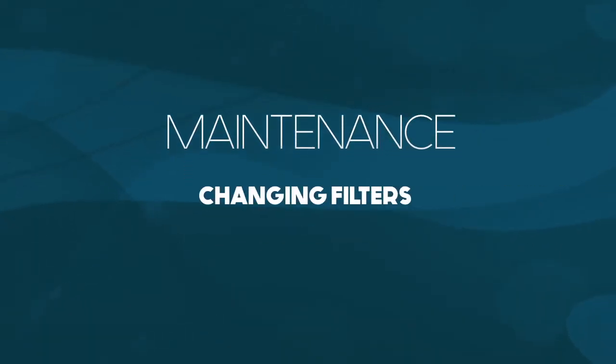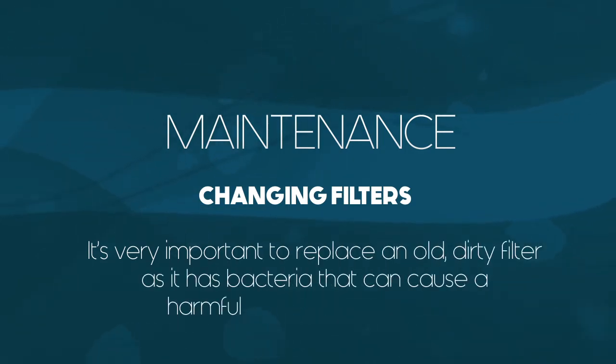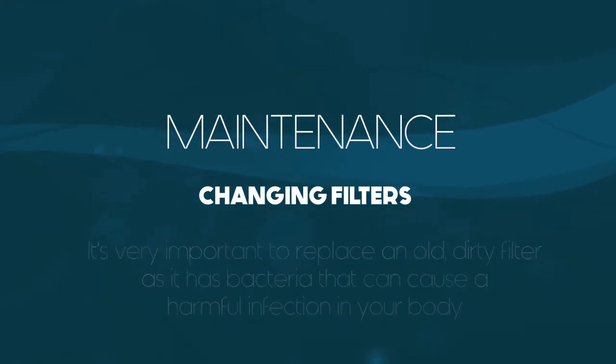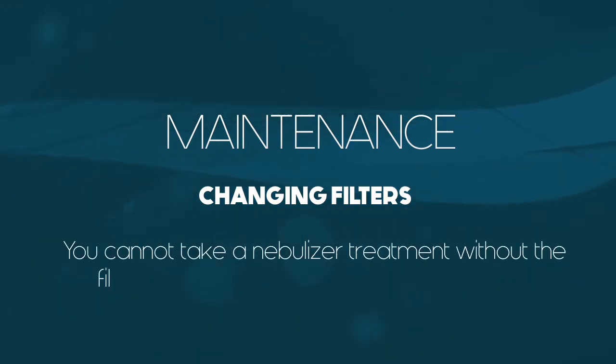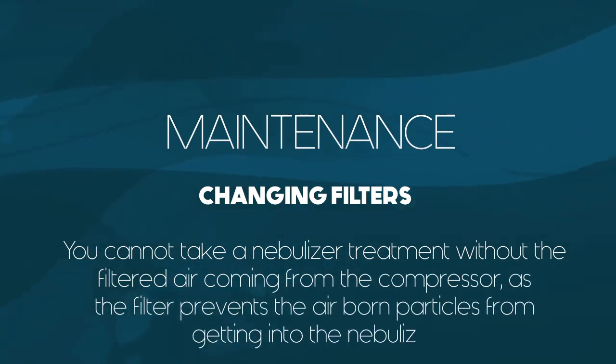Maintenance. Changing filters. It is very important to replace an old dirty filter as it has bacteria that can cause a harmful infection in your body. You cannot take a nebulizer treatment without the filtered air coming from the compressor, as the filter prevents the airborne particles from getting into the nebulizer.